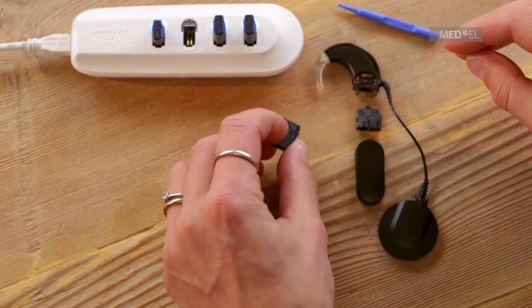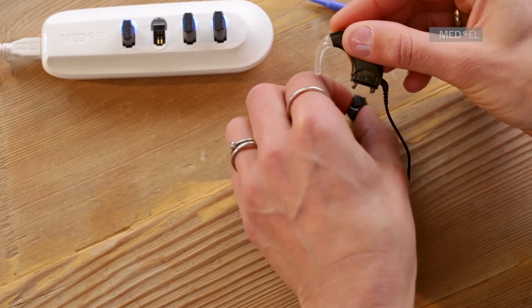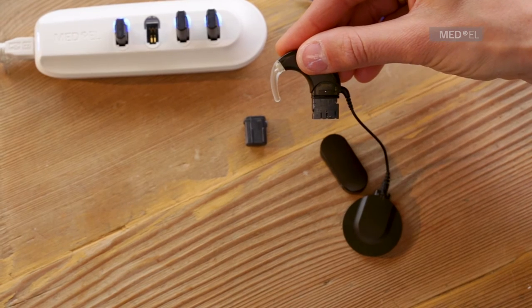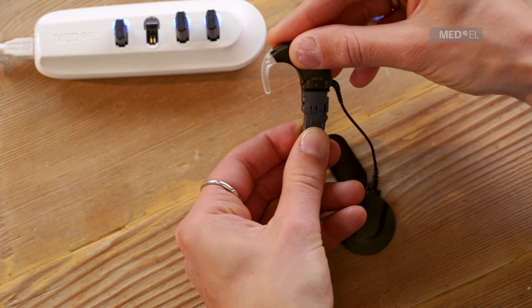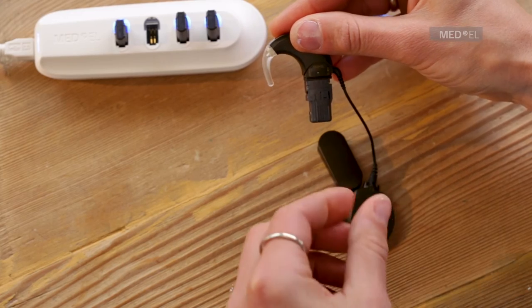Insert the hook on the control unit into the matching groove on the rechargeable battery adapter and push down until the release lever engages. Hold the battery at a slight angle with the lip of the battery touching the ear hook side of the adapter. Push down gently until the ridge of the battery snaps into place.